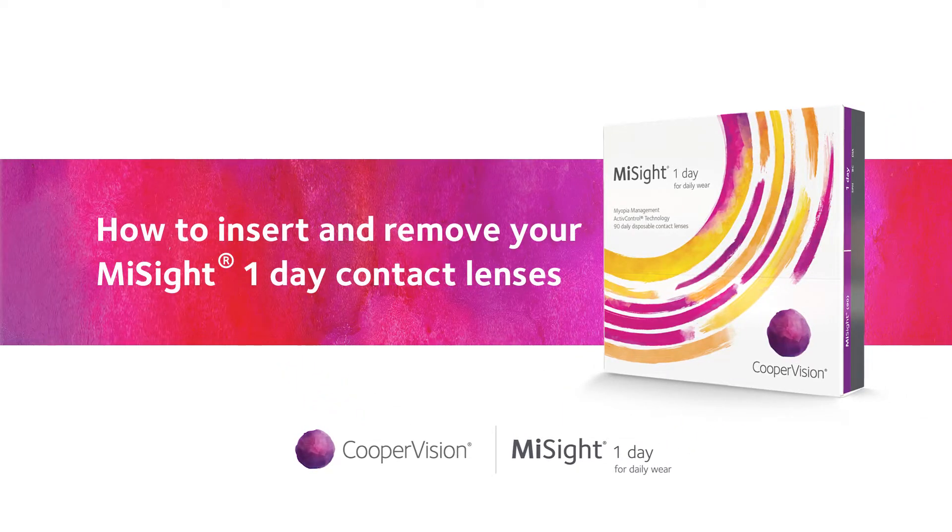This video will teach you tips and tricks to help you learn how to put your contact lenses in and take them out every day. Let's get started.